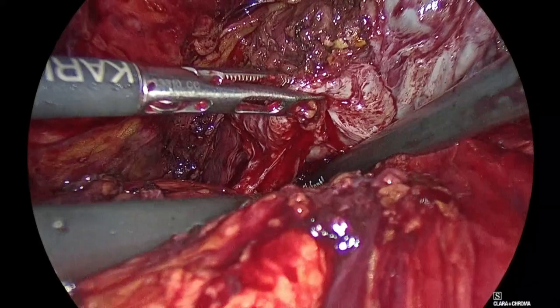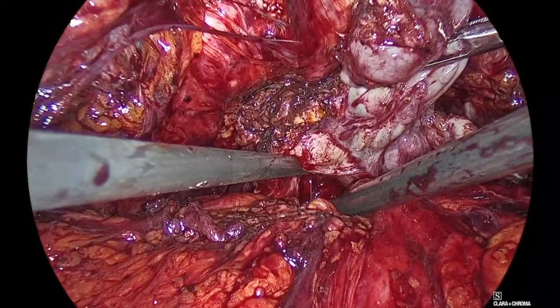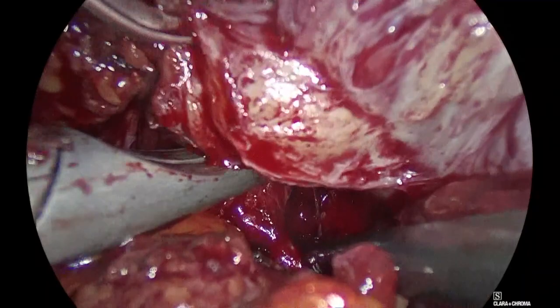And what about the types of clip you use? Medium large. Go back, Padeli. Clip. Medium large. Yeah, the Hem-o-lok. Do you ever use the metal clip? No, I don't like the metal clips. I know there are the new metal clips that double lock. I haven't tried them. But the metal clips that we used to use before, they used to slide out.